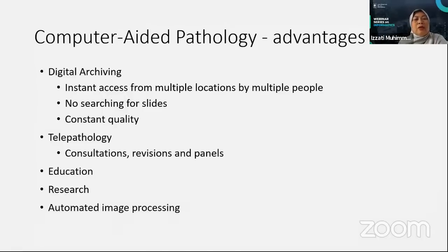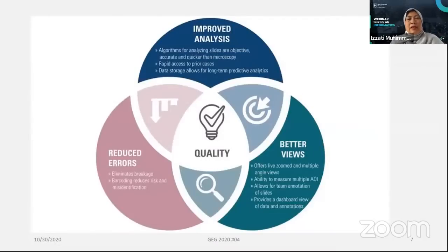As I mentioned, it will also go to automated image processing research. Here is an overview of the improvement in quality if we have the glass slides digitized. It will improve the analysis because we can apply algorithms for analyzing slides objectively, accurately, and more quickly than observation under the microscope only.